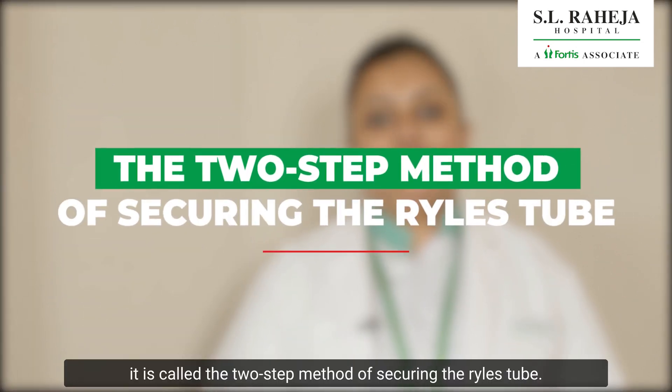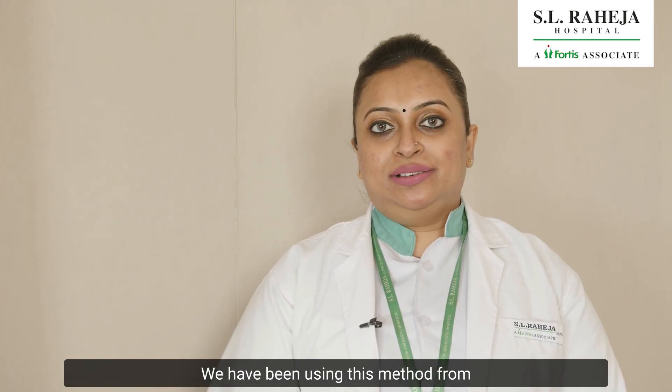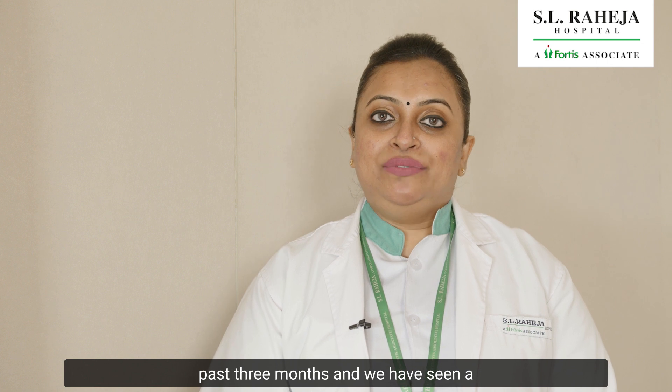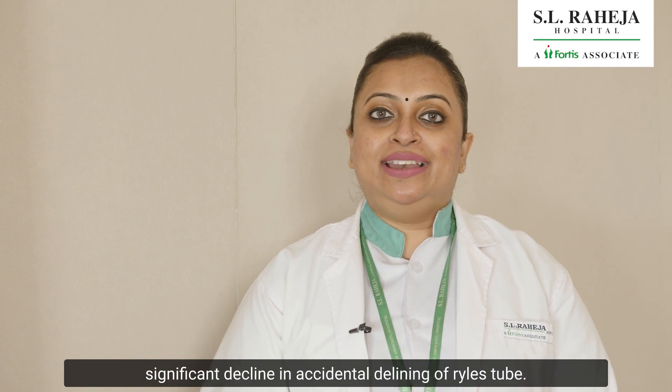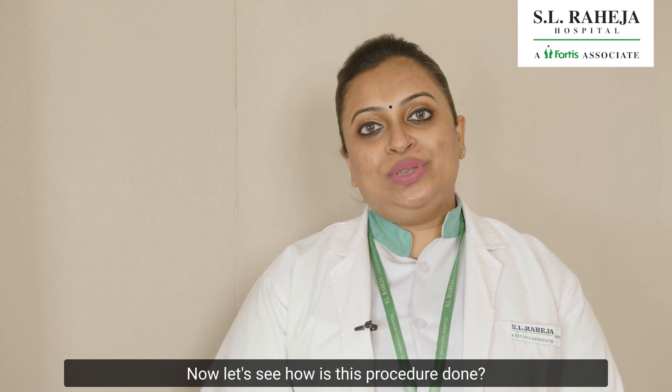It is called the two-step method of securing the Ryle's tube. We have been using this method for the past three months and we have seen a significant decline in accidental dislodgement of the Ryle's tube. Now let's see how this procedure is done.